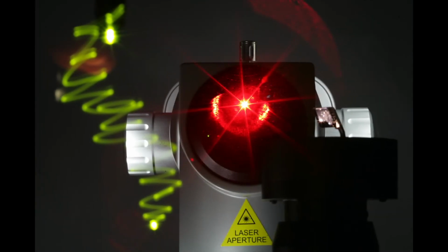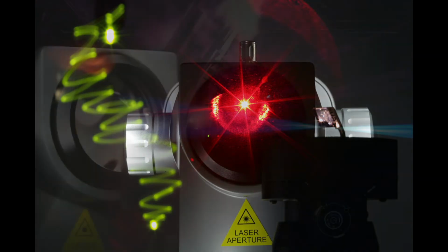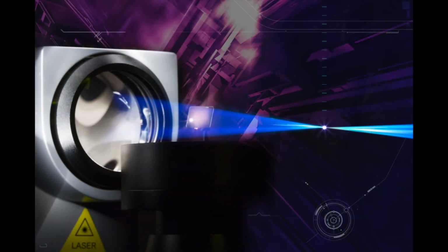Before firing the laser, let us first take a look at some basic physics. The YAG laser produces a coherent, monochromatic laser beam with a wavelength of 1064 nanometers. The laser exits through the objective lens together with the two red aiming beams at a convergence angle of 16 degrees. A YAG contact lens increases this convergence angle to 24 degrees. On the one hand, they serve to stabilize the eye, and on the other they have the function of a burning glass to further increase the energy density in the laser focus to achieve plasma formation.